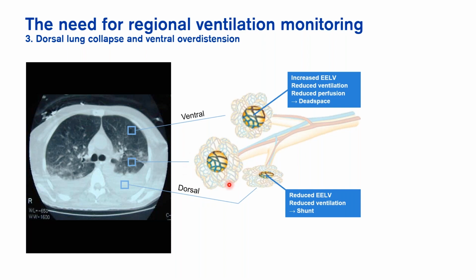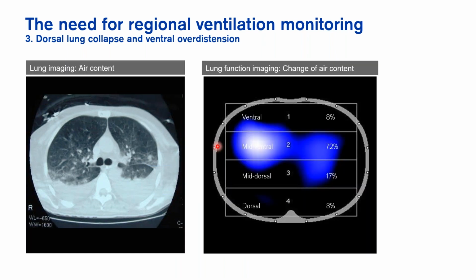And that's when I refer to the baby lung. So basically, even if we have lung protective ventilation targets of 6 milliliters per kilogram, we are still ventilating a significantly smaller portion of the lung, which can contribute, and it has been proven, contributes to the development of ventilator-induced lung injury. So how would it look on the PulmoVista?